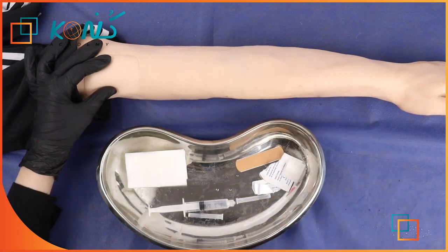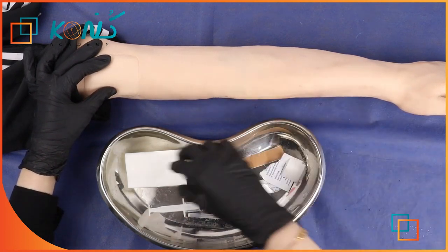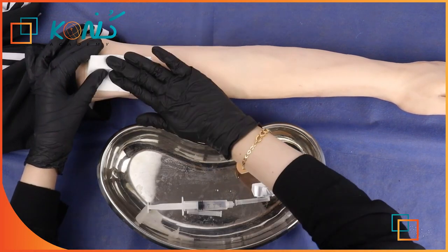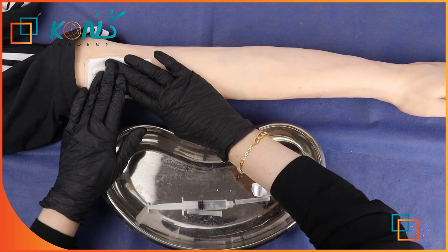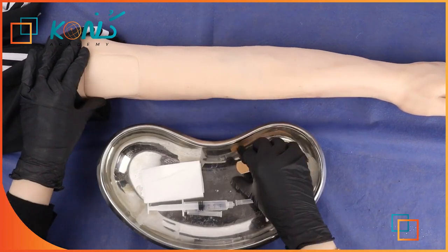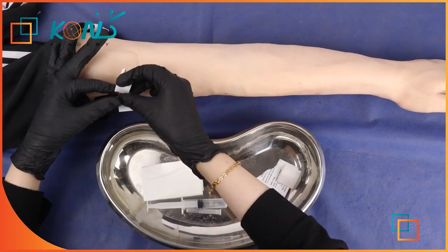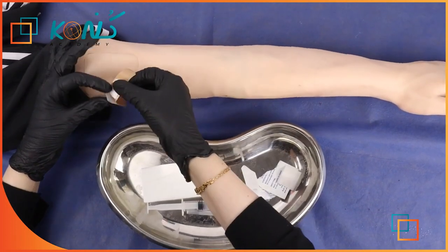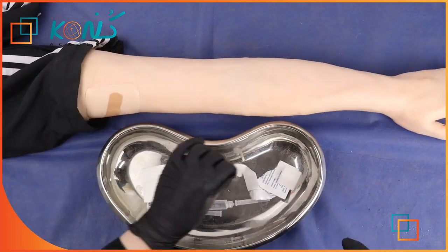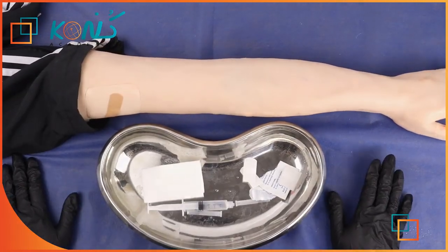remove it in the sharps waste, apply pressure, do not rub, and then apply plaster. This is how to do subcutaneous injection.